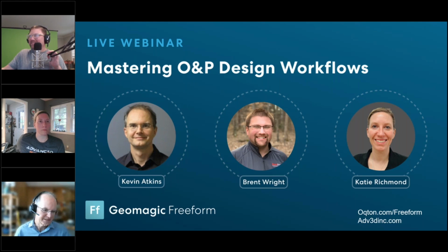We've just got time for one or two more questions. There's a question here on, where is it? Doing the export. Sorry, I'm just looking for it.